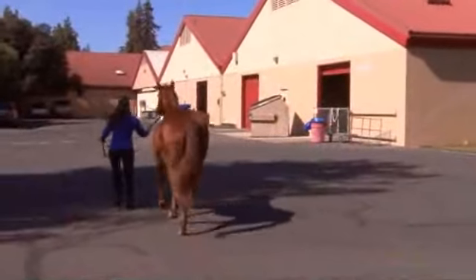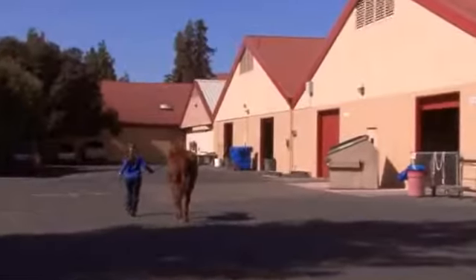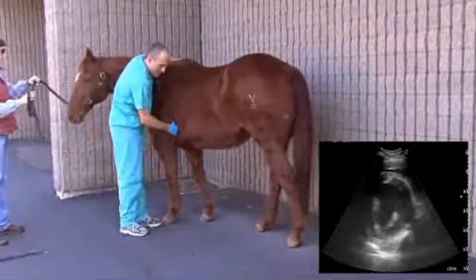After a brief trot, her heart rate is increased to about 60 beats per minute. I'm hearing lub-dub, lub-dub, lub-dub, lub-dub.